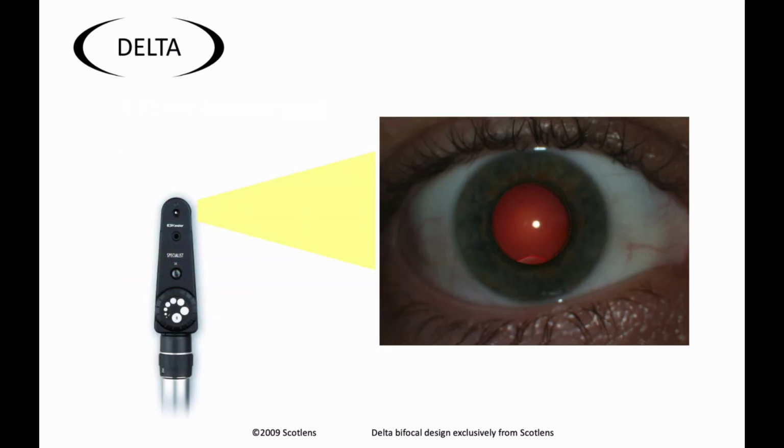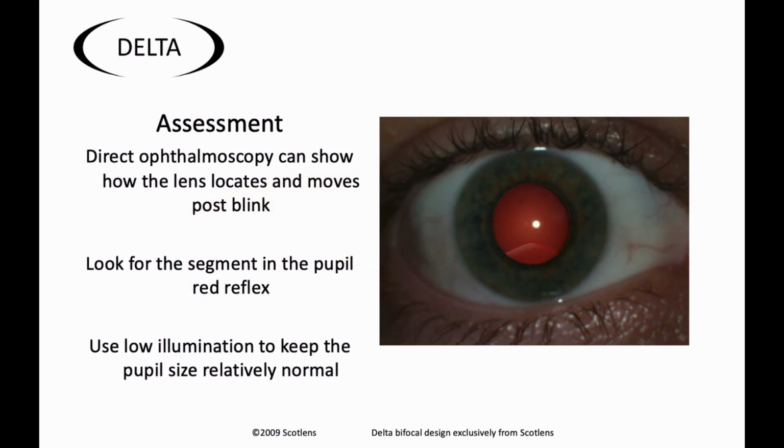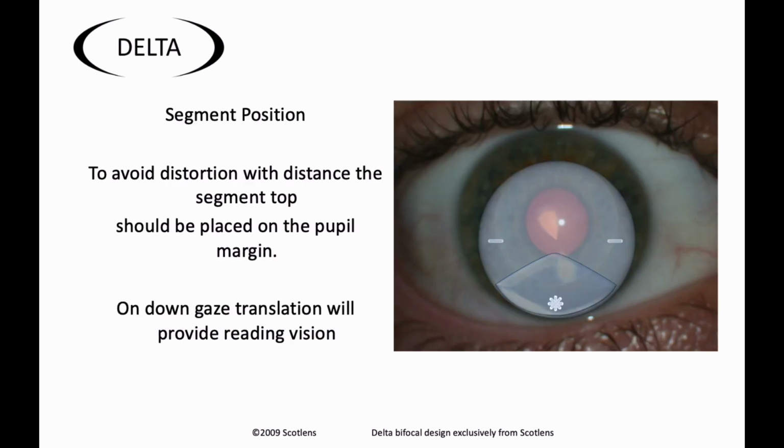A useful tip is to use your direct ophthalmoscope and look for the red reflex within the pupil. With this, you can see the movement of the lens, and it allows you to keep the illumination quite low with your direct ophthalmoscope, so the pupil size is fairly natural for the room illumination. Now the segment should be positioned roughly on the lower pupil margin. This way you'll get clear distance vision, and then with a bit of down gaze, the lens will translate up to provide the reading vision.